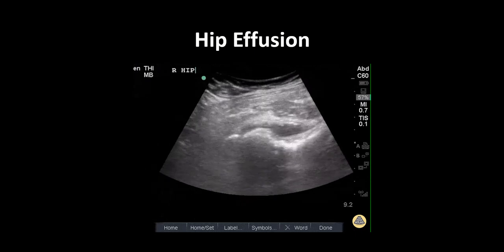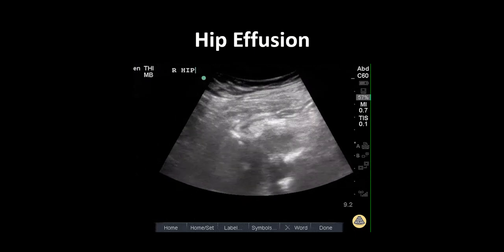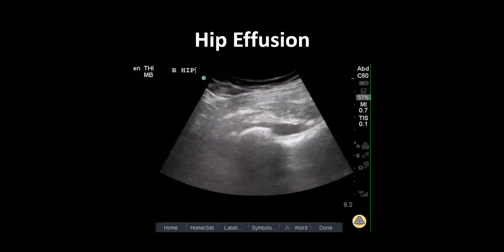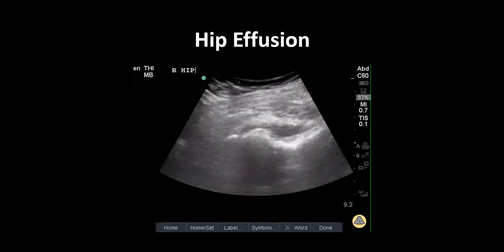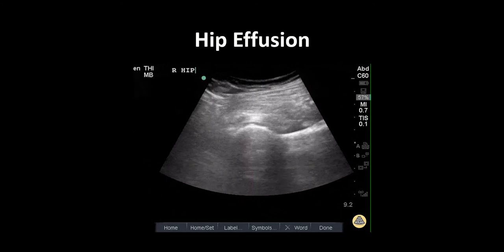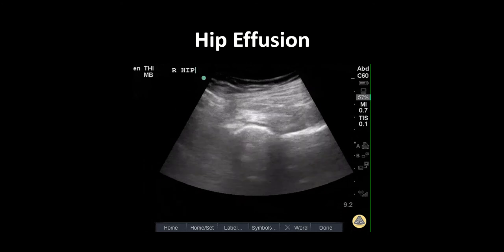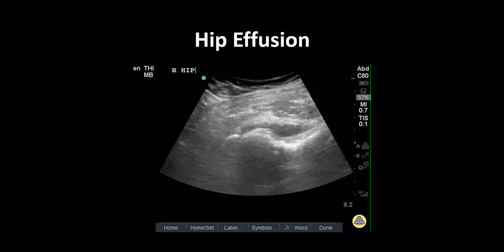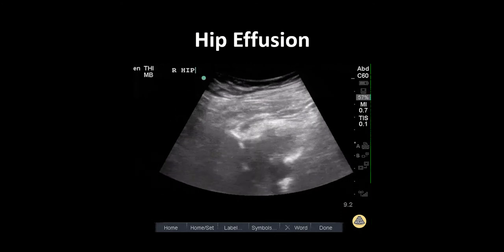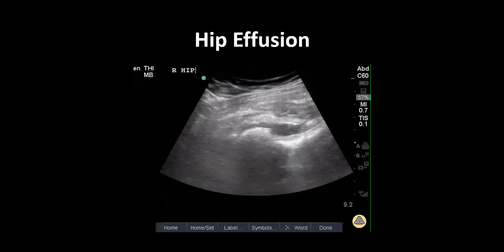This is an ultrasound clip demonstrating a hip effusion in a patient presenting to the ER with atraumatic hip pain, fever, and inability to bear weight. Initial x-ray imaging was negative.